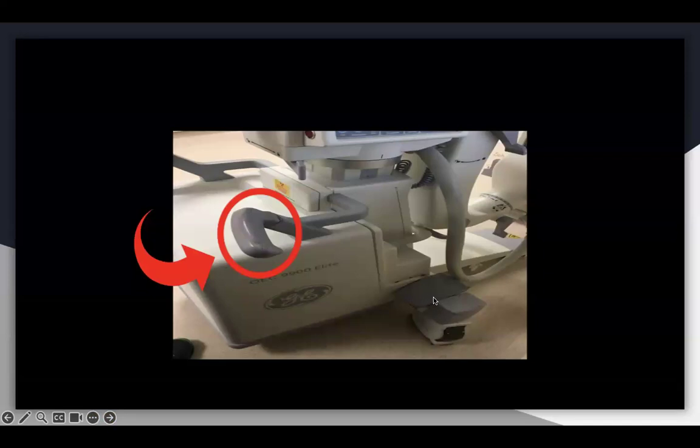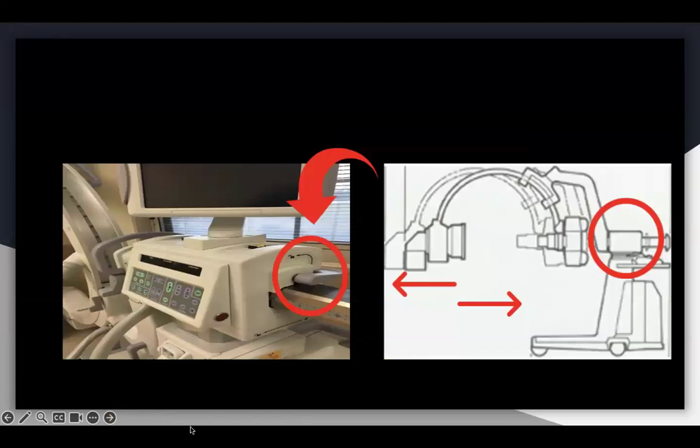So usually here's your brake right here. Usually you gotta take it off brake. And what this does is, you see how these wheels are turned to the side. Normally they would be turned facing forward because you're driving it forward. But what this lever allows you to do is turn those wheels sideways so it can go head to toe. Then if we're gonna move in and out, this button will do that. If you're standing behind the control panel, there's a button right above that tube. It locks and then it unlocks. So this will allow you to move the actual seat arm, move it in or move it out.